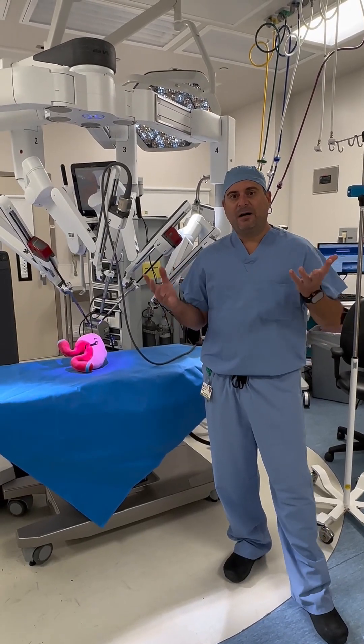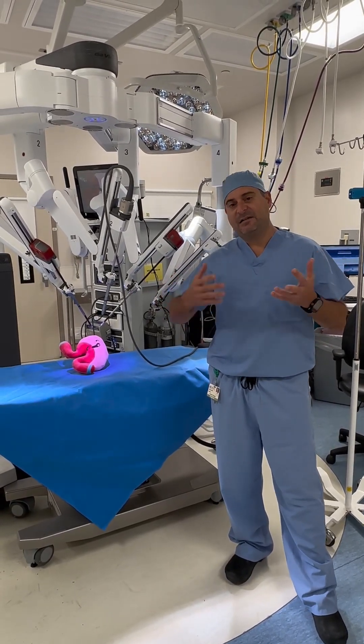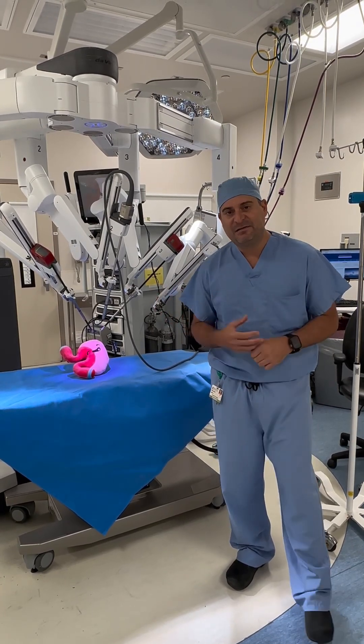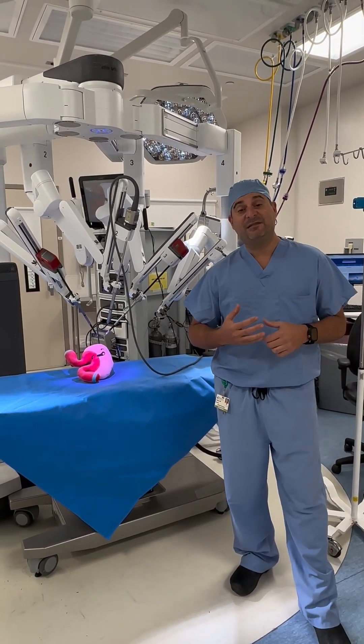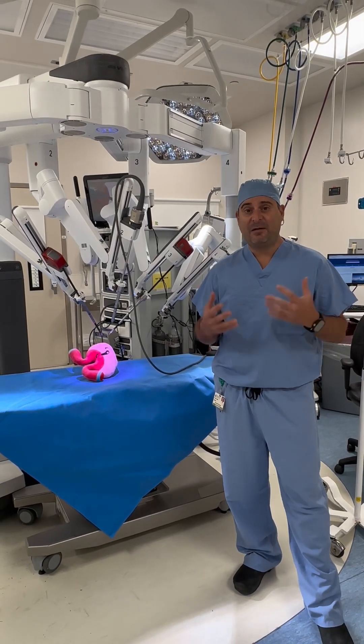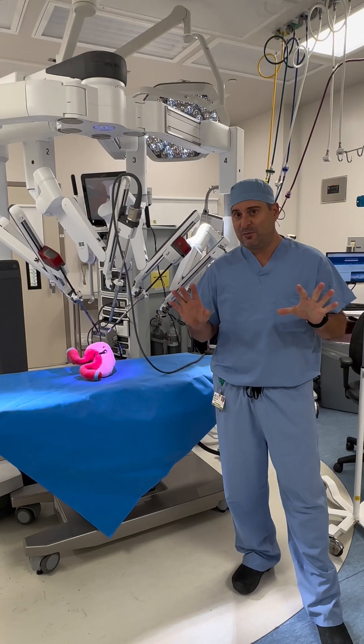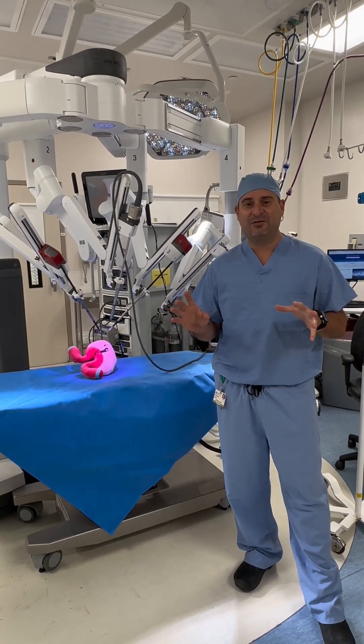Today I want to talk about what robotic surgery is and discuss the different parts of the robot. There are a lot of misconceptions when patients and physicians talk about robotic surgery. The first thing I want to address is: no, the robot is not doing any of the surgery.